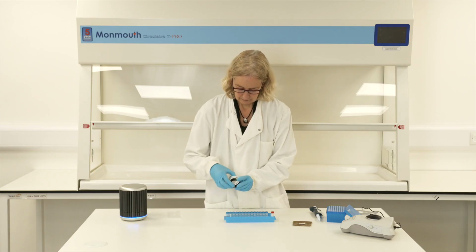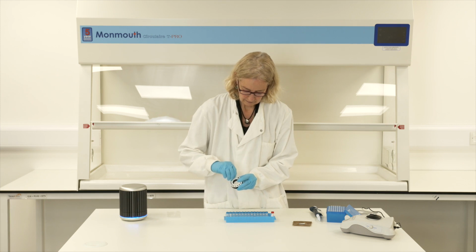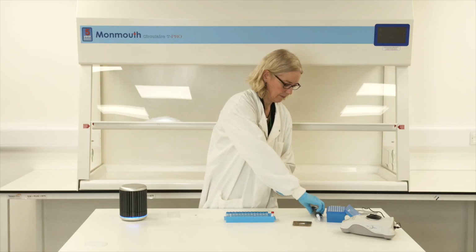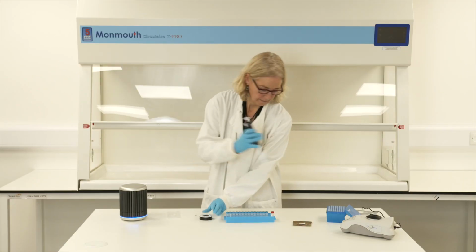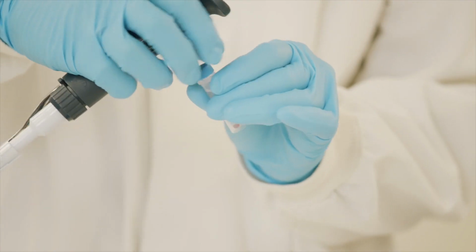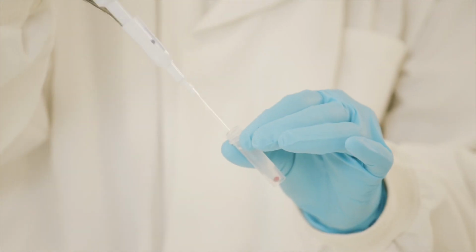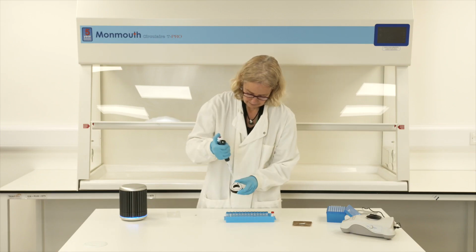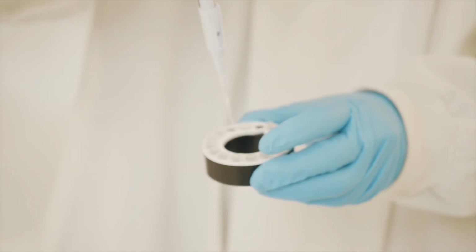Remove the foil from a qPCR reaction tube and transfer 5 microliters of the patient sample into its designated reaction tube. Once the patient sample has been added to the qPCR reaction tube, it should then be sealed with one of the clear caps provided. Repeat this for all samples being tested.